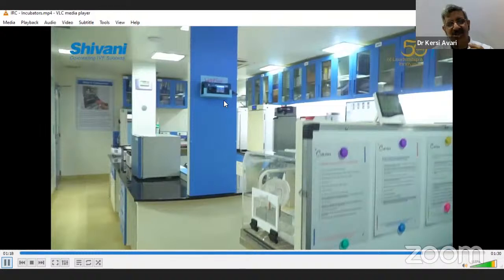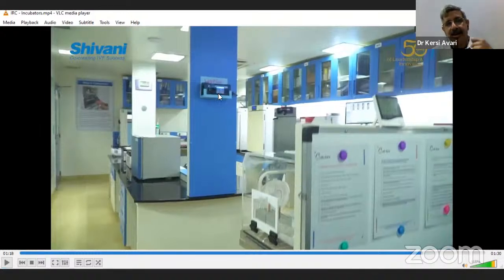This equipment monitors the lab health. Air CO2, SPMs, temperature, humidity, all the parameters, because there are multiple sensors in this. It is fitted in one corner of your laboratory or one wall, and automatically the readings are continuously recorded. This is a simple tabletop routine clock plus display plus moisture indication, but the accuracy is quite poor. The least count of the accuracy measurement is not proper.